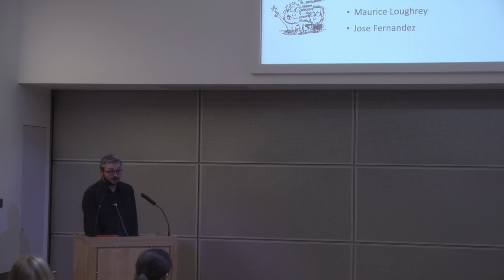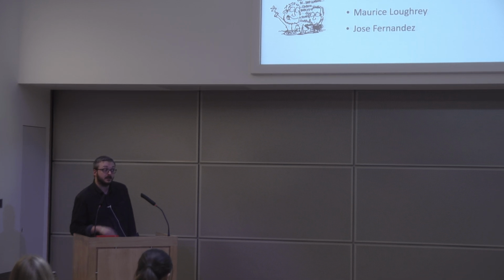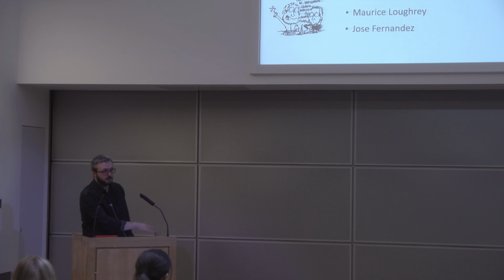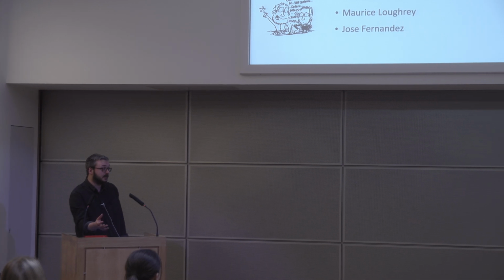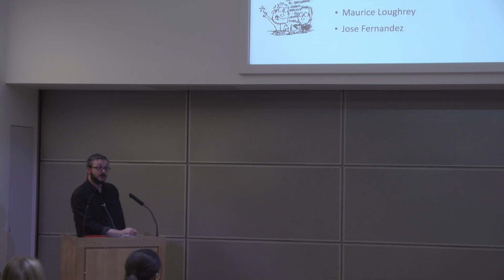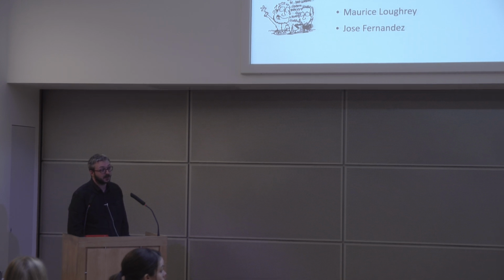So I would be interested to know where there are other types of data that this could fit in, and especially if there isn't an existing open source solution that already deals with it, because I don't want to compete with other software, even commercial software. I want to make this maximally useful as opposed to maximize the number of users. And so if there is something where you think it could fit, I would be really happy to discuss and to look at some of the data and see, can we develop the tools in here to make life easier for everybody working with it.